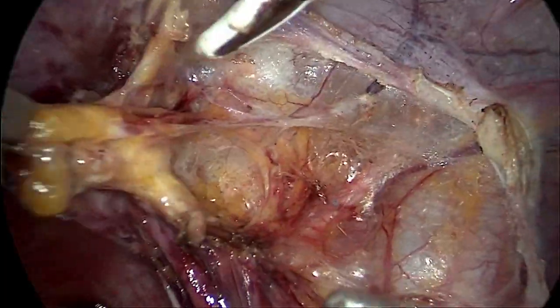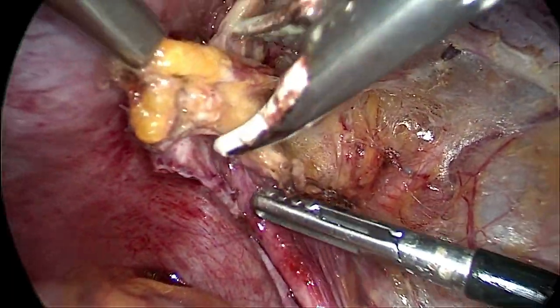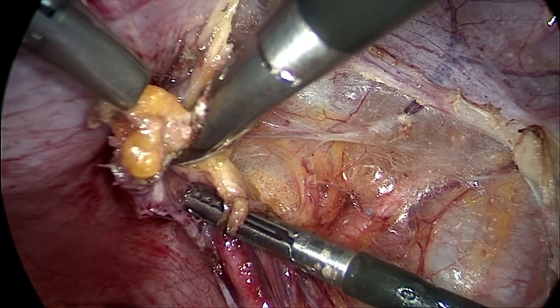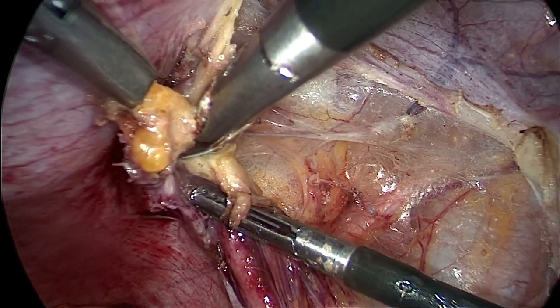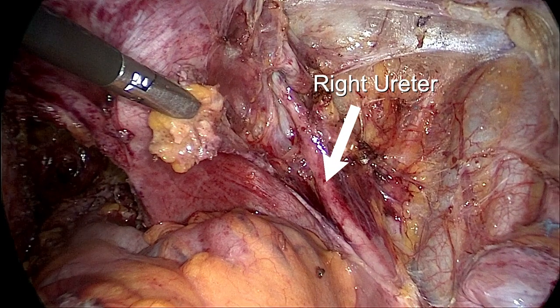The right ureter was also identified and carefully separated, followed by identification of the pelvic nerves.